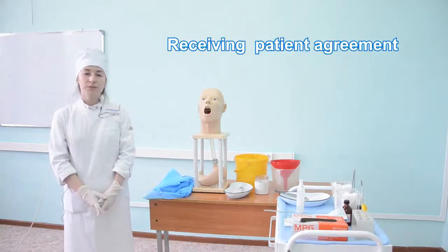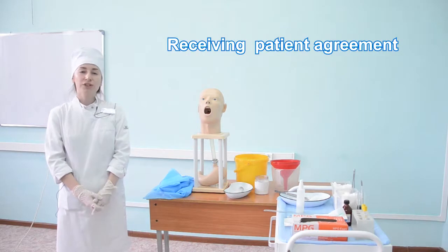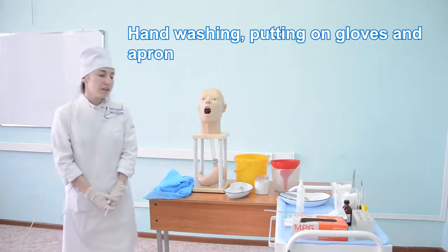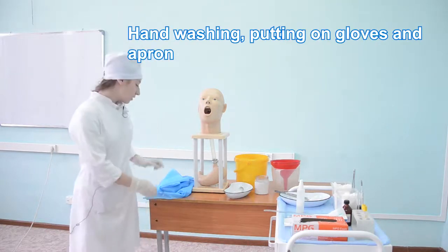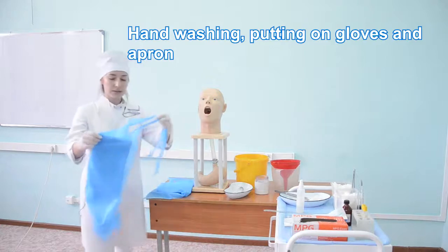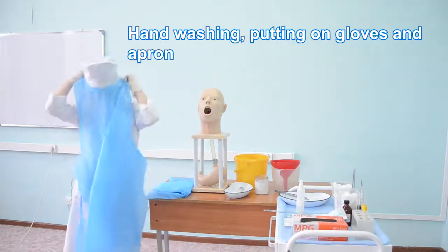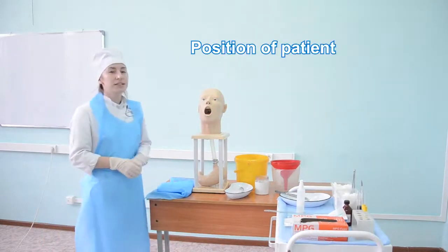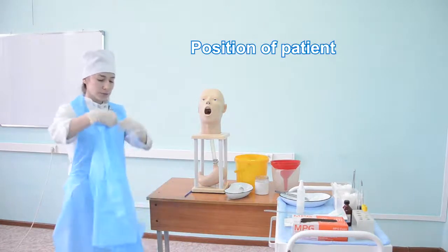The algorithm of gastric lavage starts with identification of the patient and receiving the patient's agreement. Then wash hands according to hand hygiene rules, put on an apron and gloves. Let the patient sit down on the chair and put on an apron.